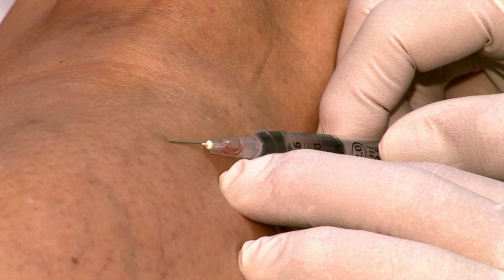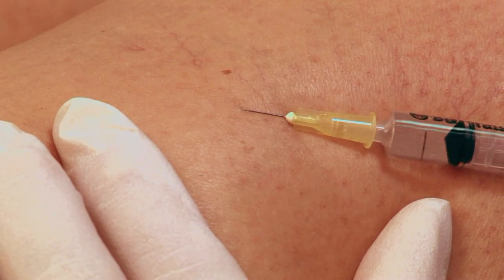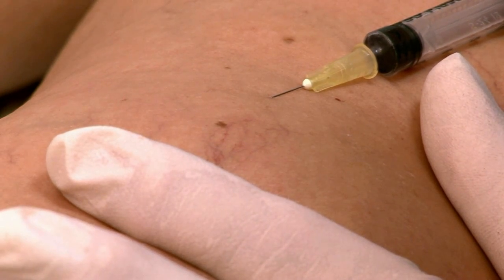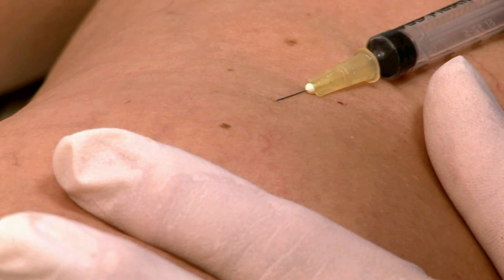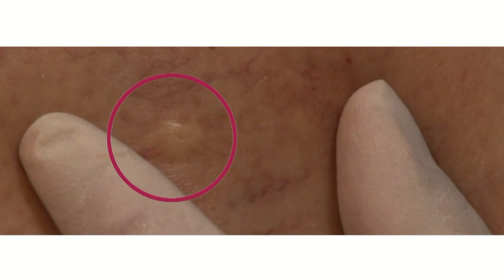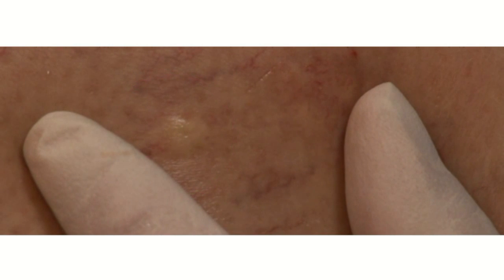Paravenous injection should be avoided. During the injection, localized decoloration of the veins occurs, as the injected sclerosing agent displaces the blood in the veins. In order to prevent side effects, the application of strong pressure should be avoided during the injection. Paravenous injection results in the development of a wheal. In this case, the injection must be stopped immediately, and also if the patient complains of severe pain.